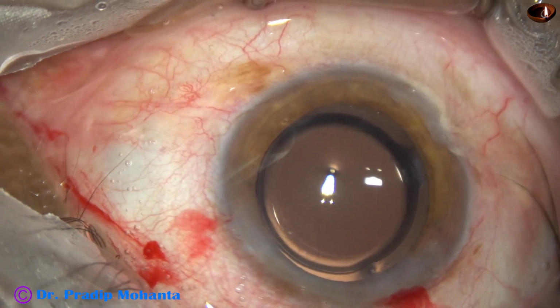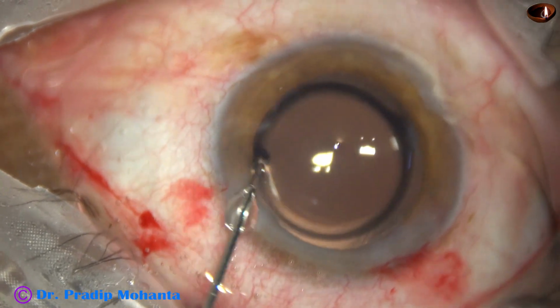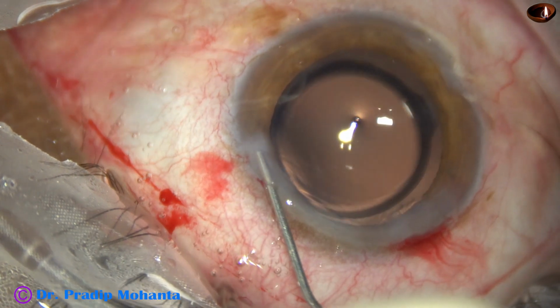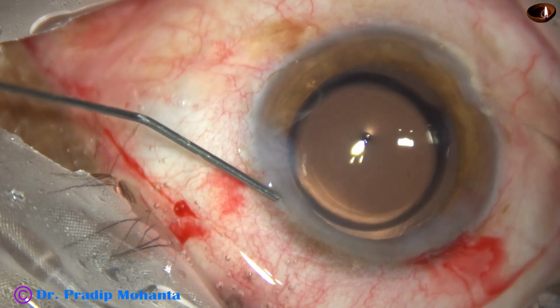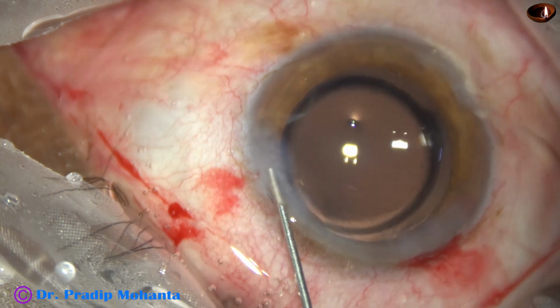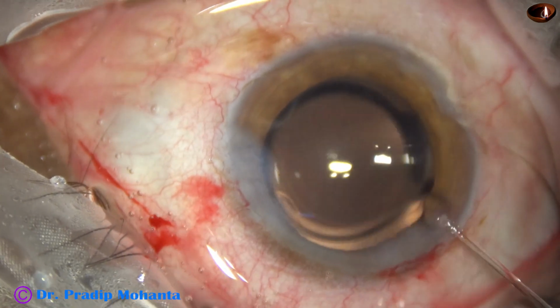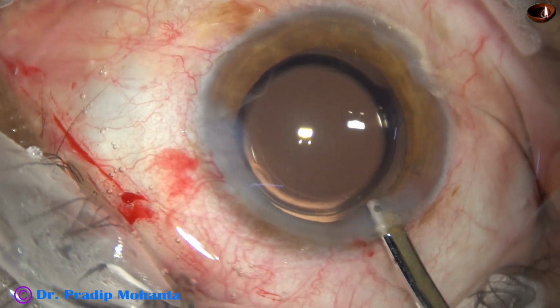If we clean the visco, give quality time to remove the visco, then the chance of IOP rise because of retained visco will be minimized or eliminated, and the patient will be very comfortable. And now this side port is closed by corneal stromal hydration. And now a final lavage by the 26G Simcoe.